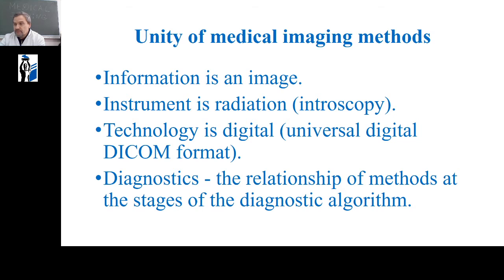The third component is obvious, but it needs to be emphasized. All these images are digital, but there is a feature that any image has a universal format. It's called DICOM.